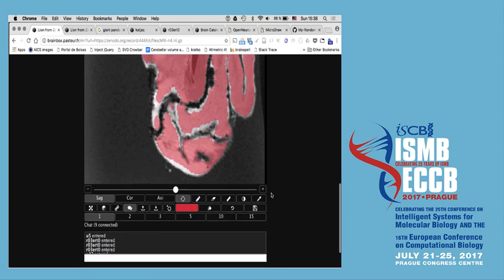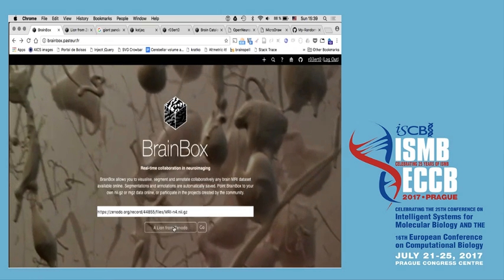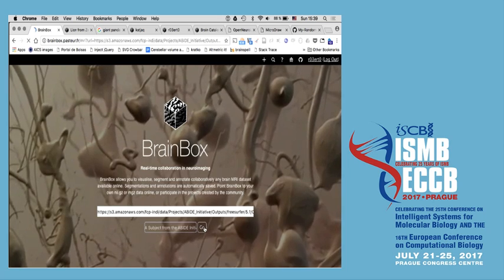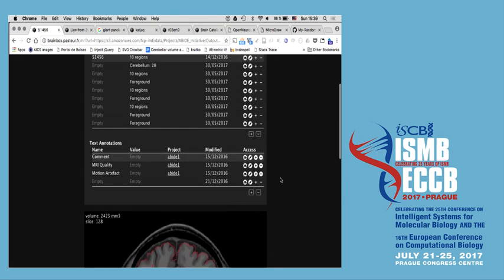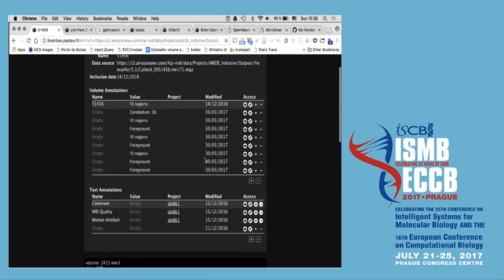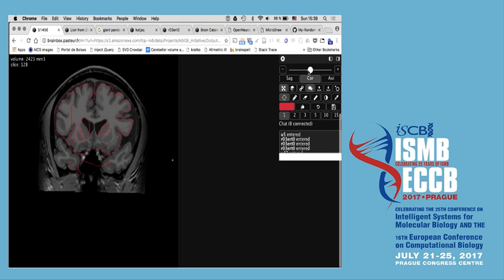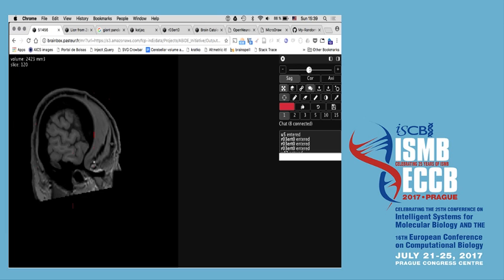Okay, and this is just one; maybe I will not go too fancy. This is a lion brain. But to stay more serious on topic, this is one brain from the ABIDE initiative, to study autism, the brain imaging of autism. You can see already that there's a lot of annotation associated with this data set. Any should do, but here you can visualize the data, so go through the slices without having to install basically anything.